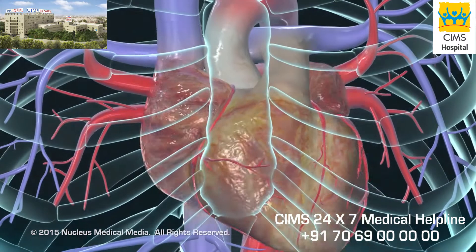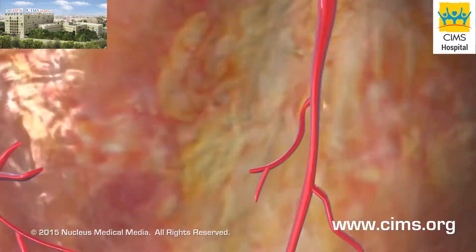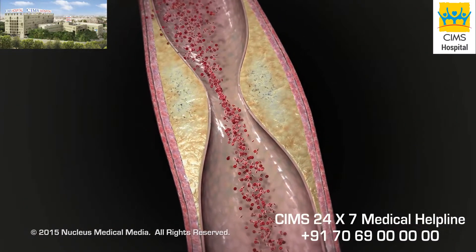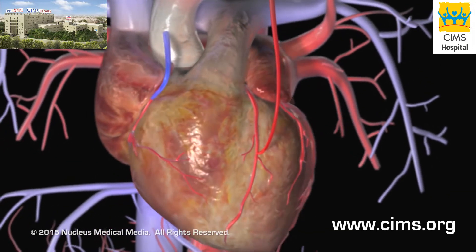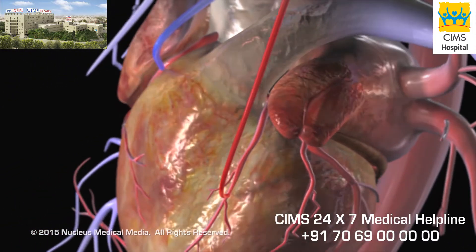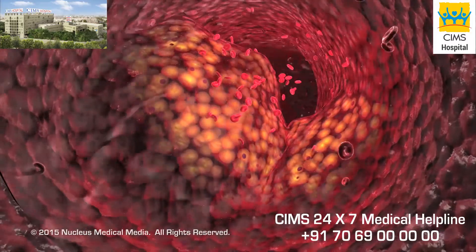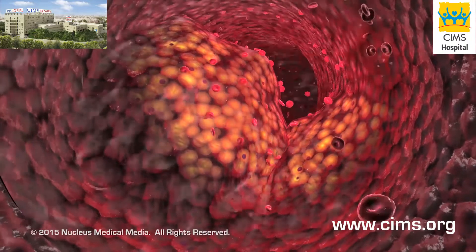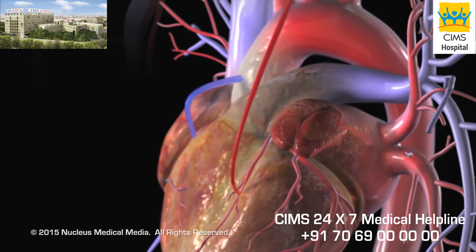A coronary artery bypass graft, or CABG, is performed to improve circulation to the heart muscle in people with severe coronary artery disease. In this procedure, a healthy artery or vein from another part of the body is connected or grafted to the blocked coronary artery. The grafted artery or vein bypasses the blocked portion of the coronary artery, carrying oxygen-rich blood to the heart muscle. One or more coronary arteries may be bypassed during a single operation.